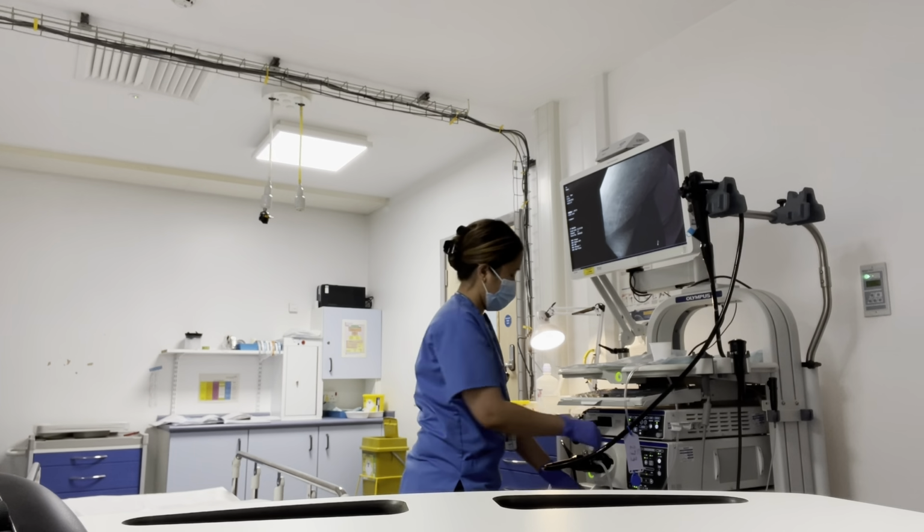For room one, the one who will do the procedure, who will scope the patients, is a nurse endoscopist. So mostly the patients are for gastroscopy procedures and the other one is for colonoscopy. One is both gastroscopy and also colonoscopy. In room two, the one who will scope is the consultant.